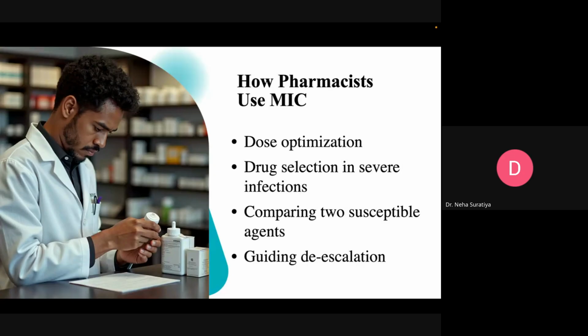You are a pharmacist, you have an idea about MIC written in the report. Piperacillin tazobactam 8 microgram चाहिए होगा to kill the bacteria, and meropenem जो है हमें 0.25 microgram चाहिए होगा to kill the bacteria. Now you know कि अगर less dose required है तो वो potent option है. ठीक है, potent option है. Meropenem is a potent option for this particular condition.